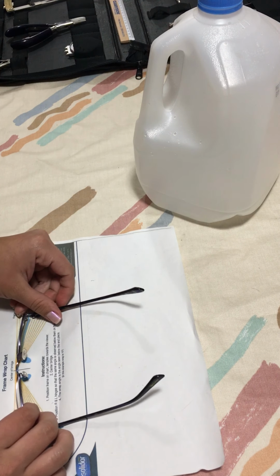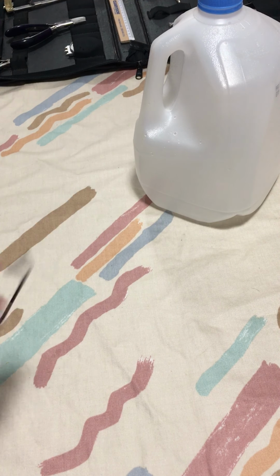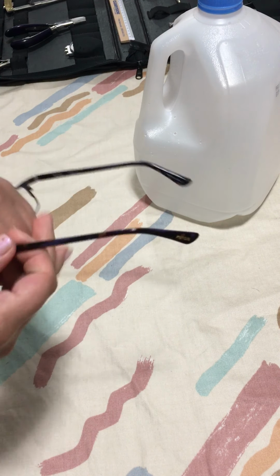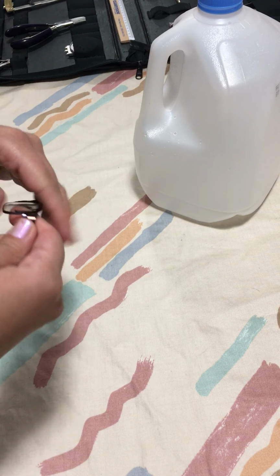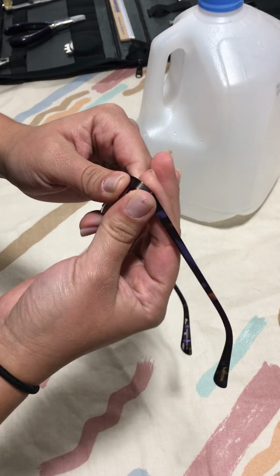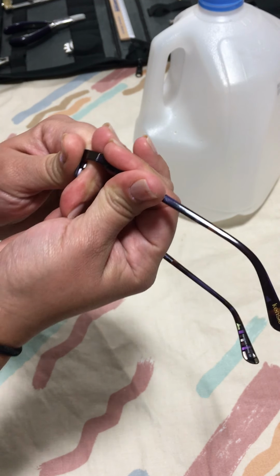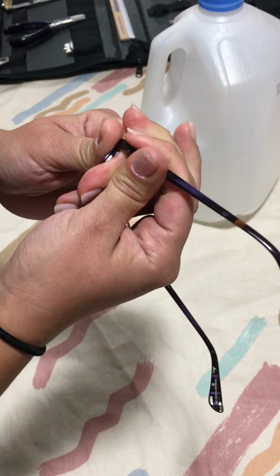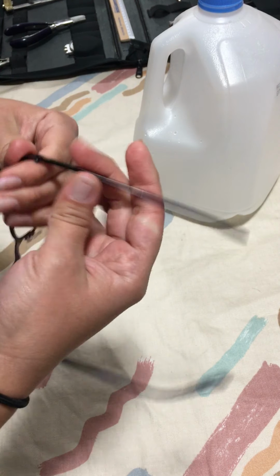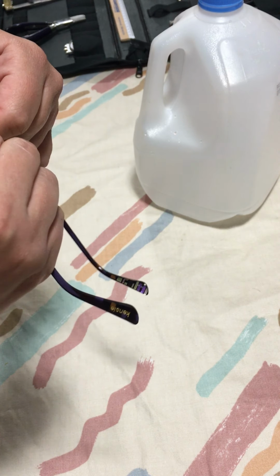And I noticed that it has a little bit too much. So what I am gonna do is, I could be using a wide angling plier to remove a little bit of the pantoscopic tilt to it. In this case, I am gonna be using my fingers, okay? Because the frame is a little bit hard. So what I'm gonna do is I'm gonna hold it hard here, and I am going to press upwards, okay, like that, okay? And this side too. So I'm gonna be holding it hard, and I'm gonna be pushing it upwards.